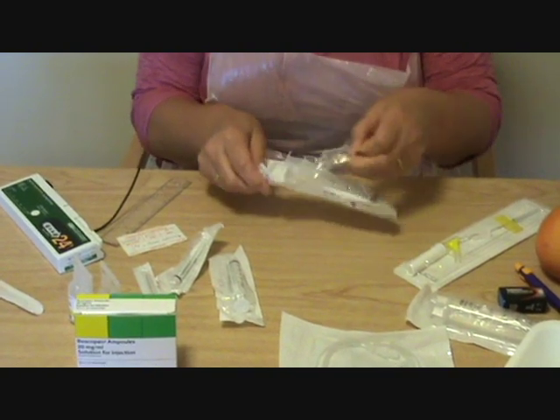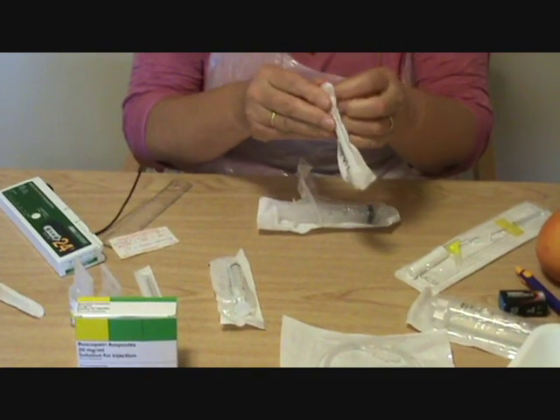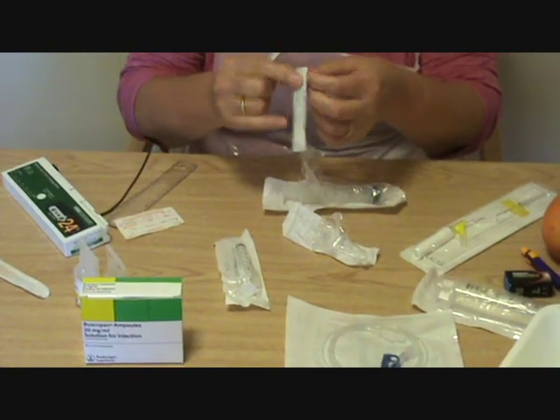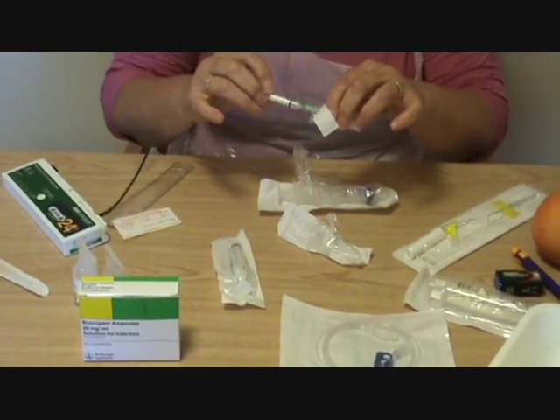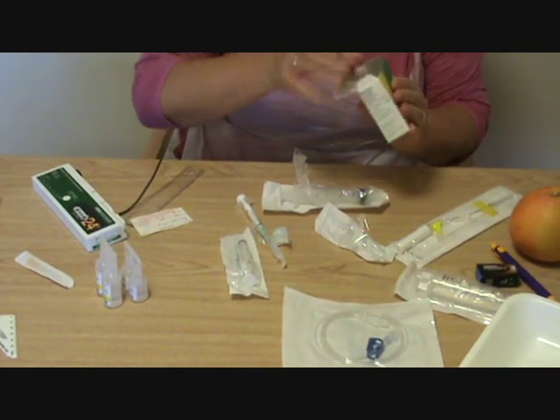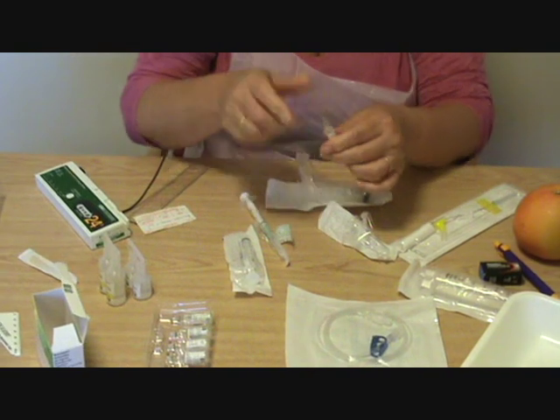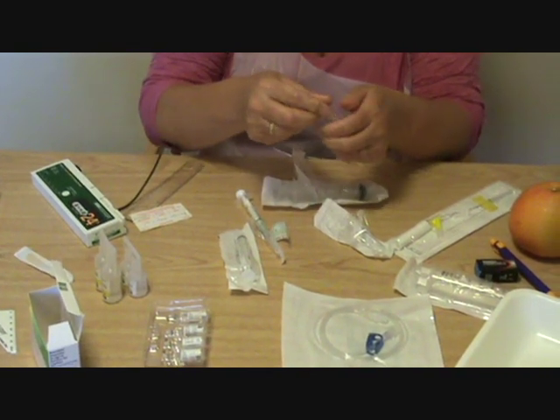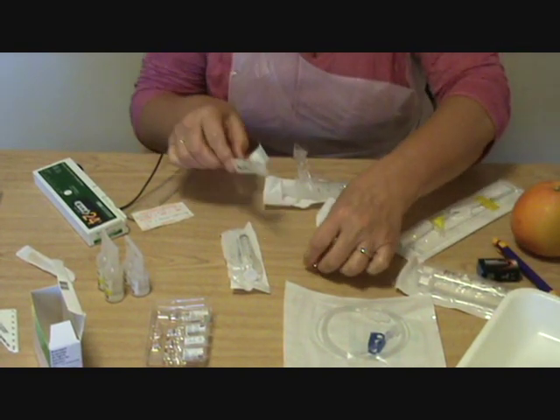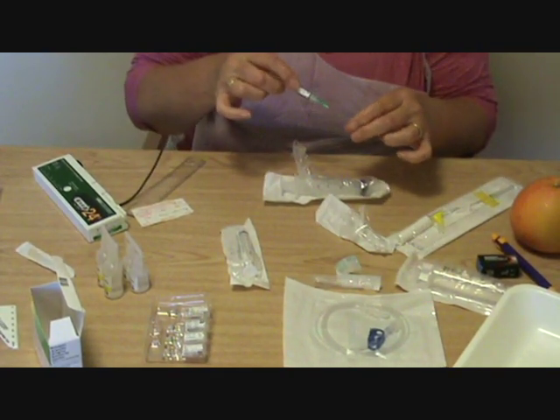Let's start by opening that. You can keep it in there and it keeps it nice and clean and sterile. You can have a few more of the small syringes too, because you might want to get a stat dose of your drug. If you arrive at home and somebody's got pain or a symptom, you might want to use a small syringe just to draw up a stat dose and give it subcutaneously.